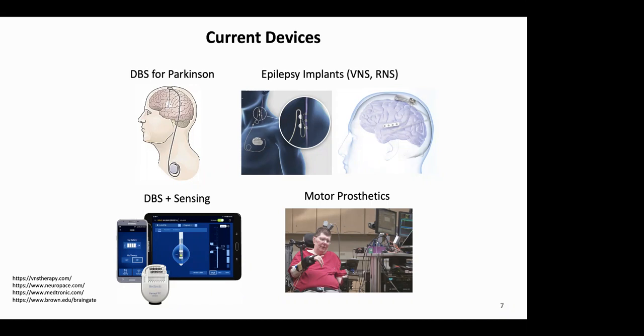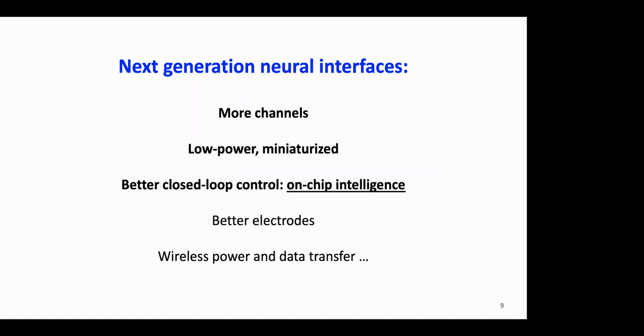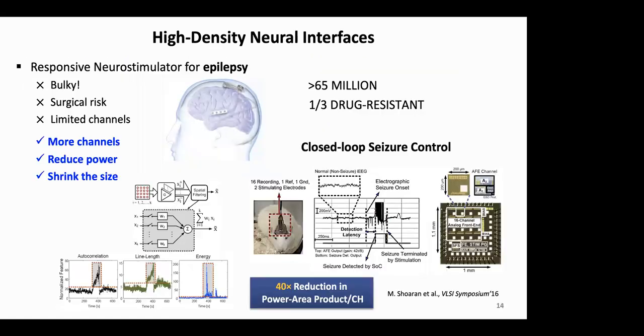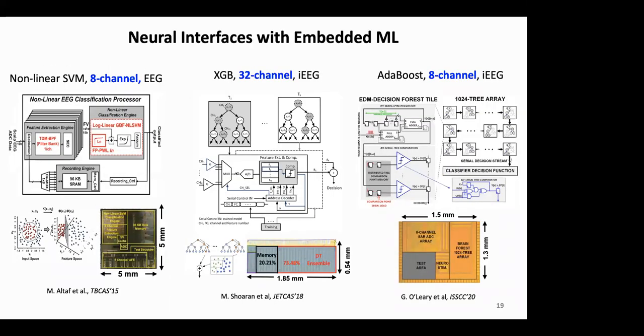So, Mahsa, related to Omid's question a little bit, you talk about the simplicity or the complexity of the algorithms. Again, you have competing design ideas. On the one hand, you want intelligence close to the sensor so you can have short control loop times. On the other hand, you want the simplest device possible so that when it goes wrong algorithmically, or when you need to update it, you don't need to. What are your thoughts on the feasibility of having a device similar to what you've described that could be remotely upgraded, so you could have evolving algorithms or bug correction or whatever?